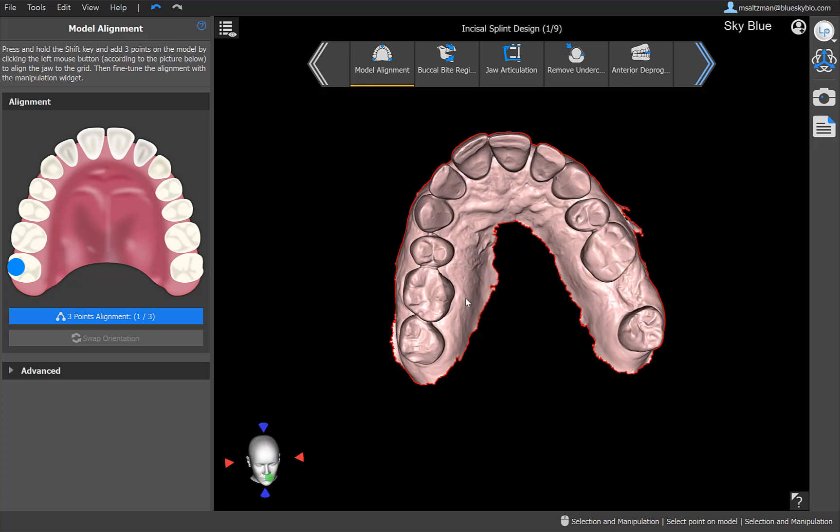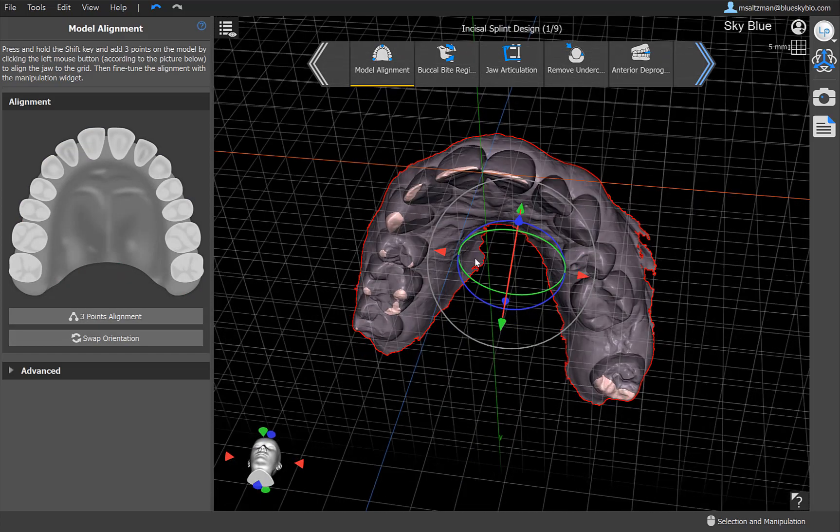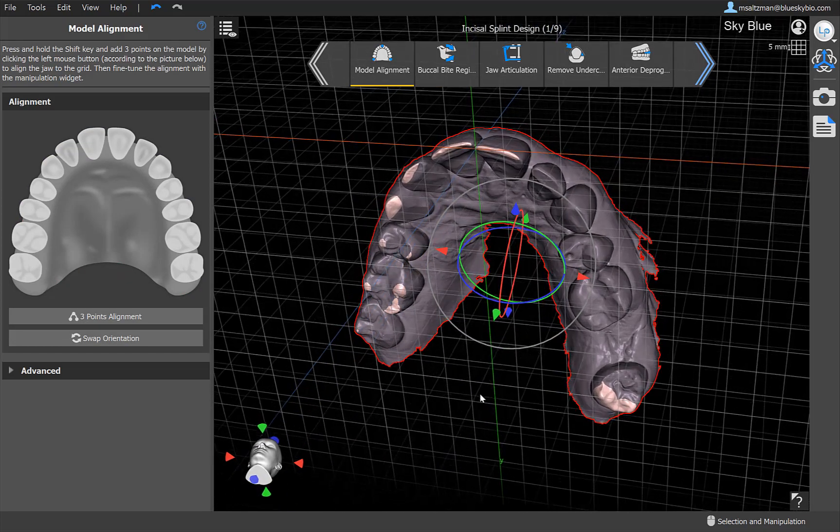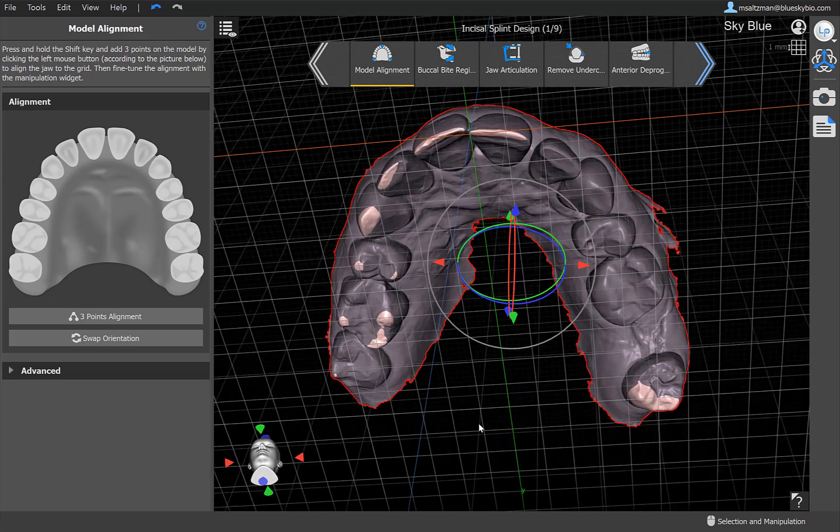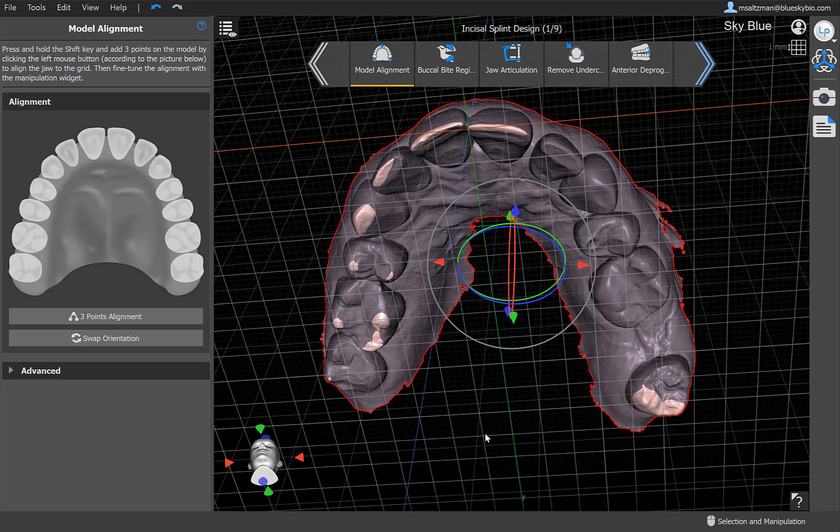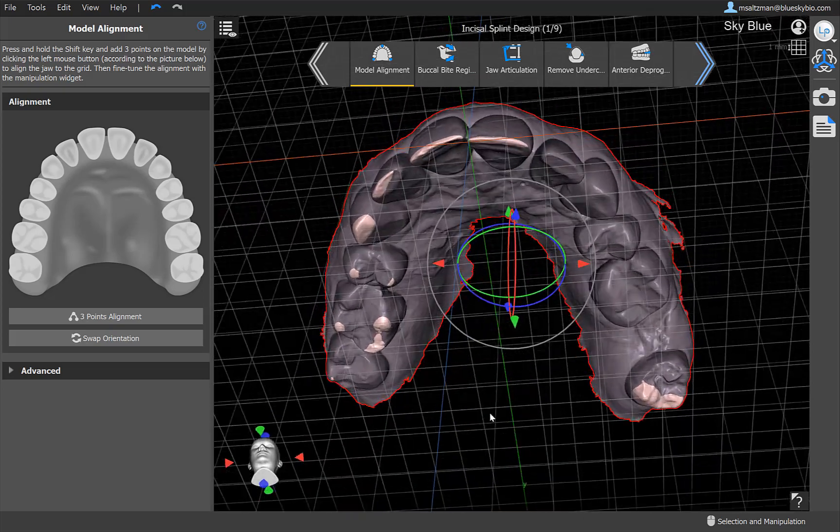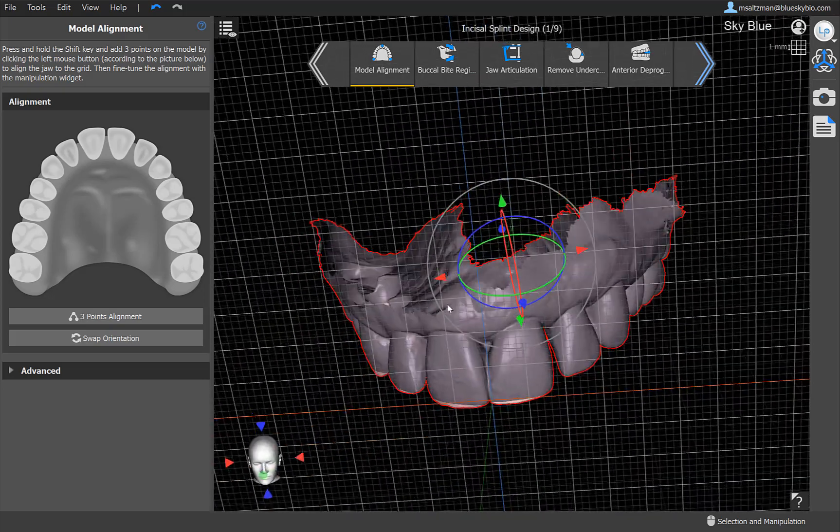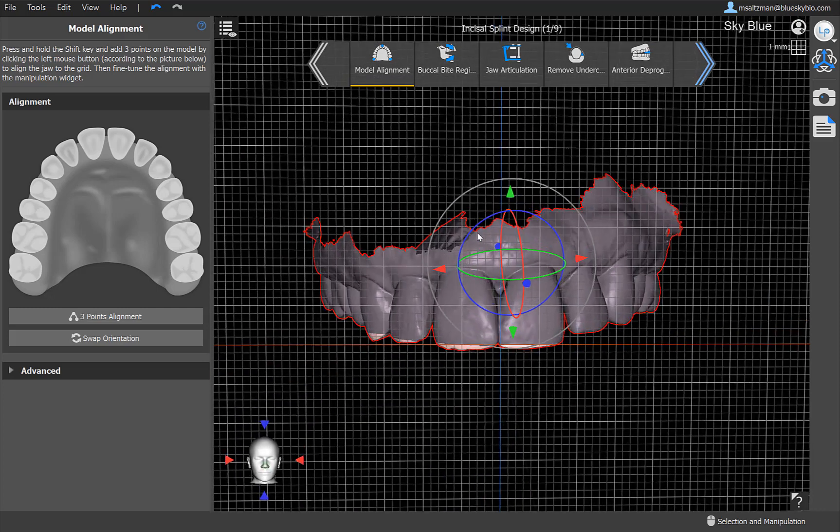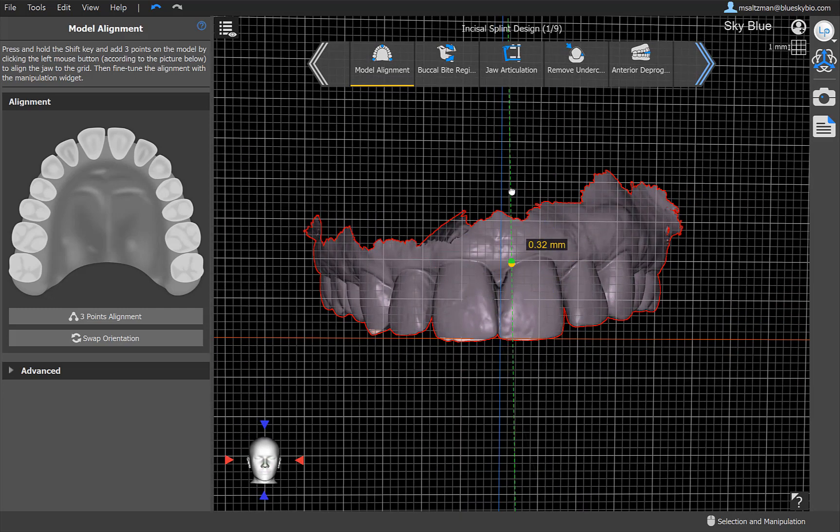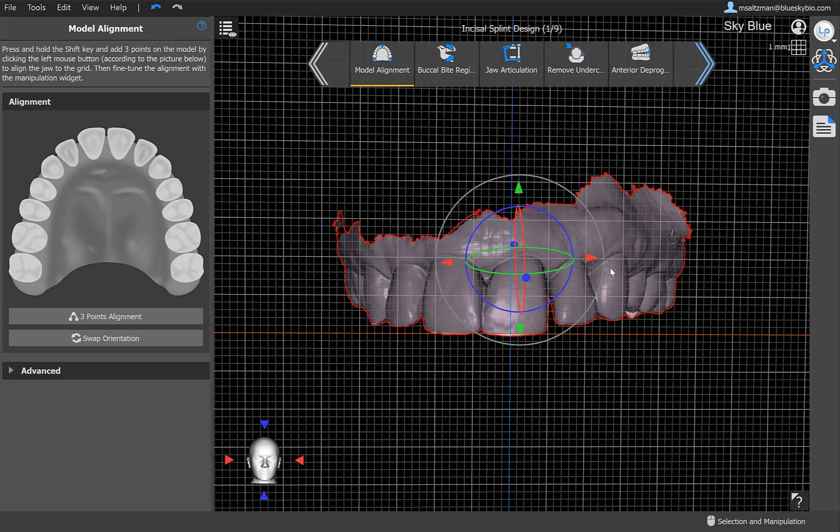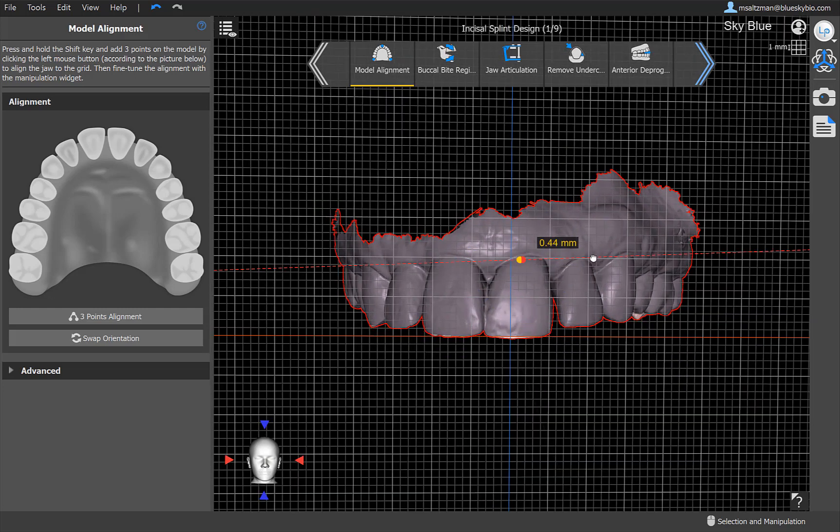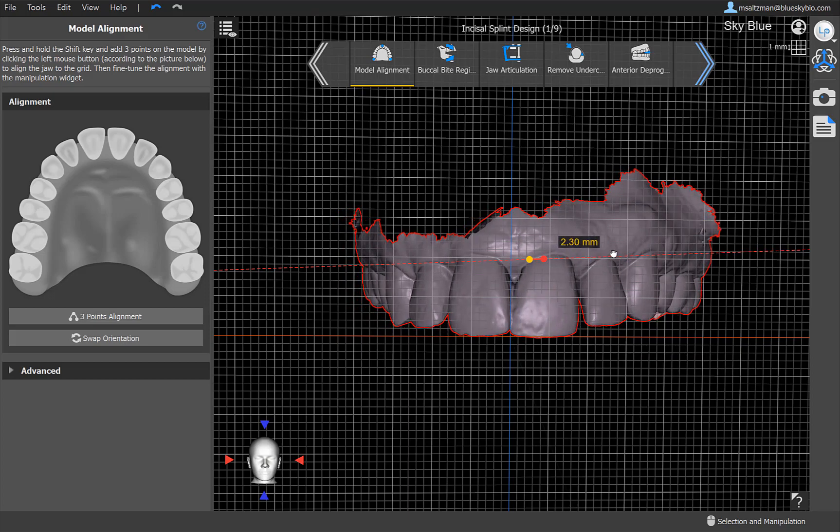Now we're at the model alignment stage that we all know and love from previous versions of Blue Sky Plan, where you mark three points on a horizontal plan and it aligns the model. I did that by holding down the shift key and left clicking to mark the points. Throughout the Blue Sky Plan software, the functionality is the same. Generally the mark points is holding down the shift button and left clicking. We can now see the model positioned on a grid in space. We could fine tune the alignment, we could adjust as we see fit. And of course, the mouse functionality is the same mouse functionality that we've had always in Blue Sky Plan.